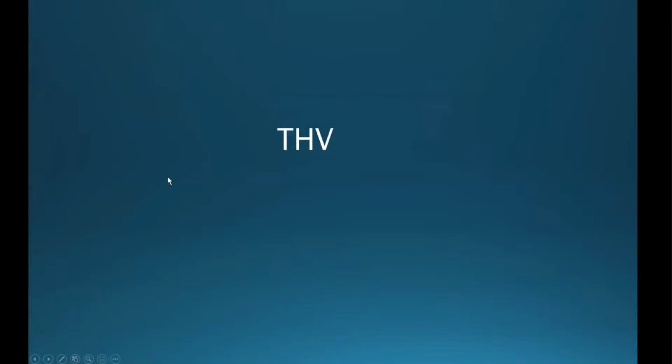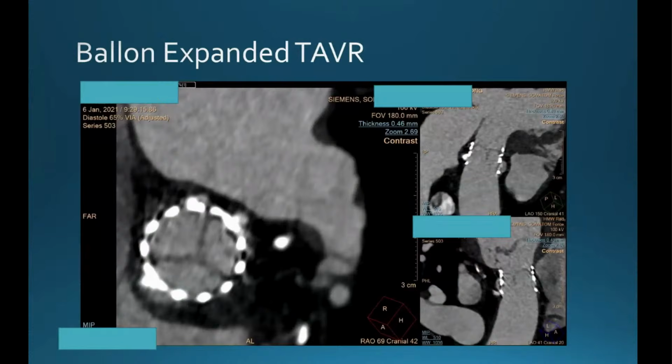Okay, so now let's switch focus to the transcatheter valve. So of the most common types of valve, there are two for the aortic valve position. This is the balloon-expanded valve, or Sapien valve. Essentially, it's an alloy frame with bovine pericardial leaflets. That's Sapien. As you can see, this is placed almost exactly at the same level where the aortic valve would be. Okay, so this is the leaflet. This is a little bit higher.